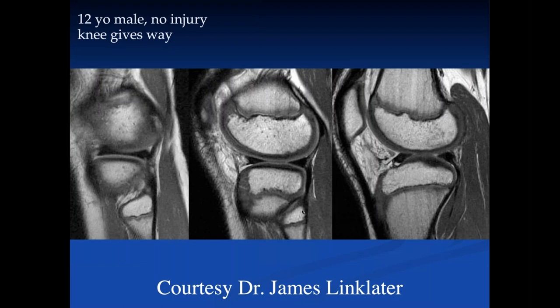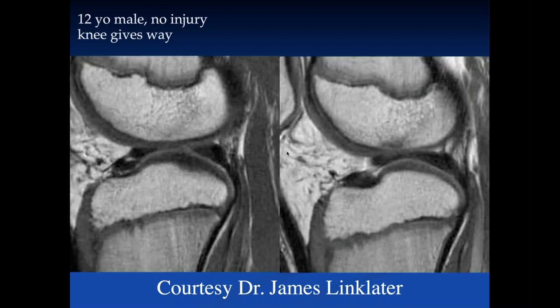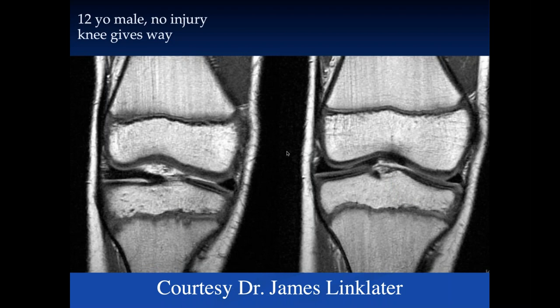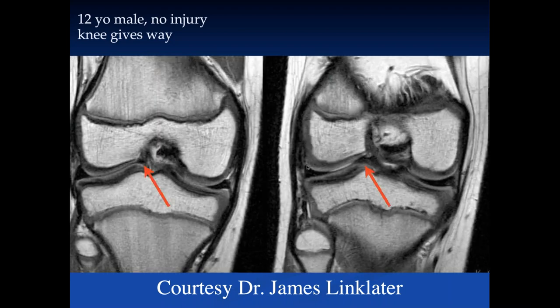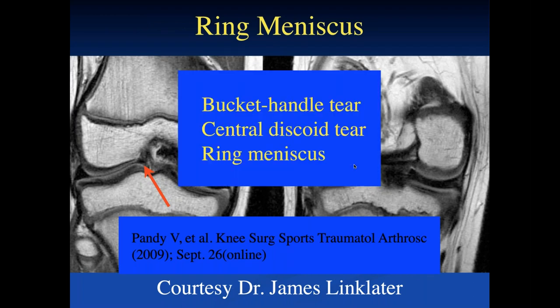When meniscal variants are nice and sharp, without abnormal signal intensity, and the rest of the meniscus is normal, they're probably normal variants. Here's a 12-year-old male with giving way. The typical portions of the lateral meniscus are unremarkable, but more medially there's a connection between the anterior and posterior horn along the notch, with the rest of the meniscus looking very normal. On coronal images, the peripheral part is nicely triangular with a sharp free edge, and this central component is also triangular — this is a ring meniscus, a congenital variant to differentiate from a bucket handle tear.